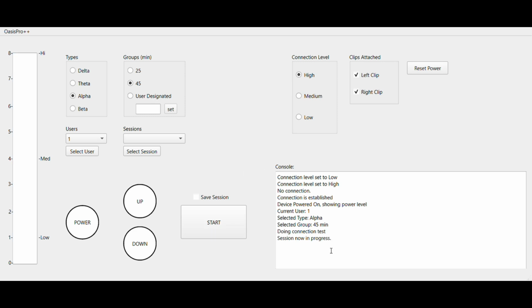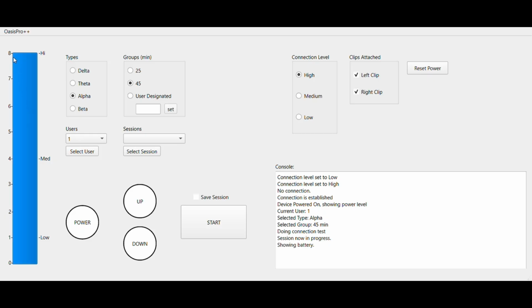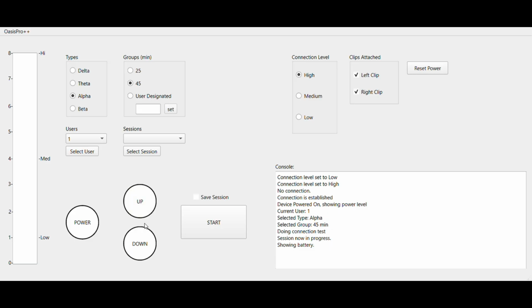And what you'll see is session now in progress. It shows the connection. The connection's high, so it's good. You can start the session. And you'll see in about 10 seconds, the battery level will appear. So see, it's 8. It hasn't drained yet. That's because the intensity hasn't been adjusted. So you're at 0. You're not feeling anything yet.